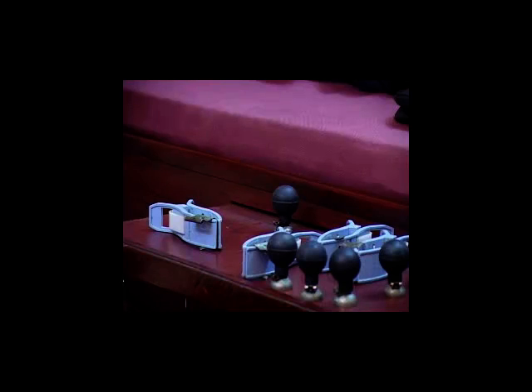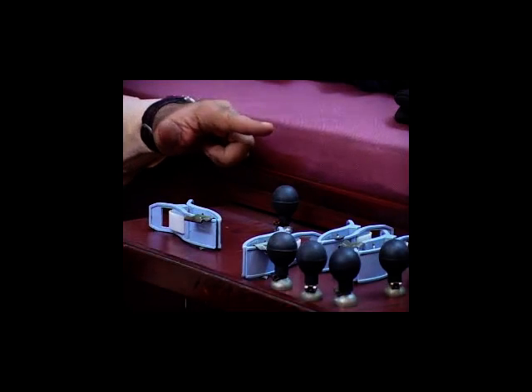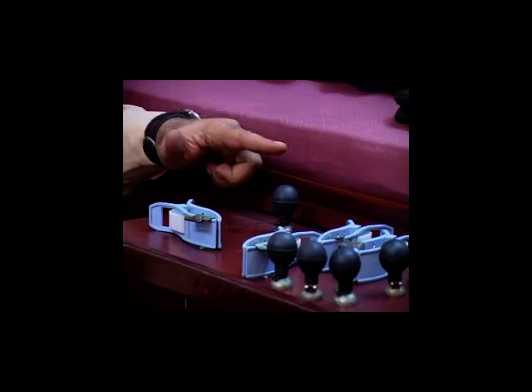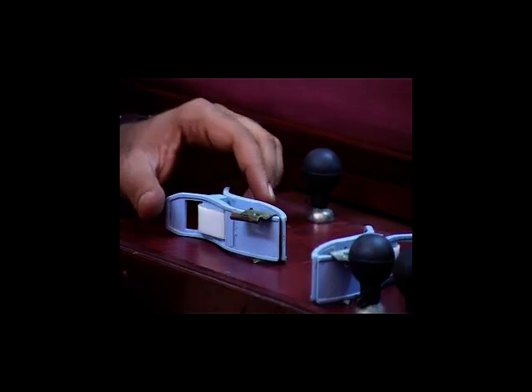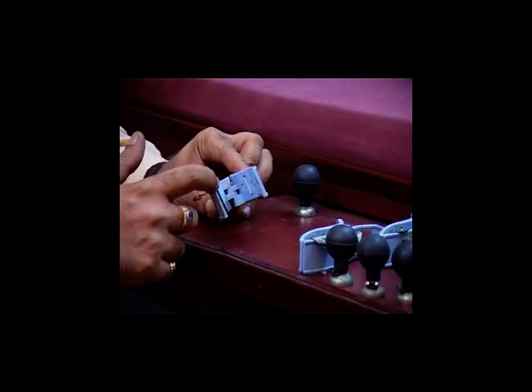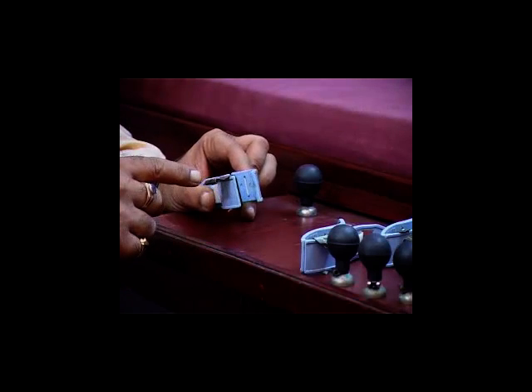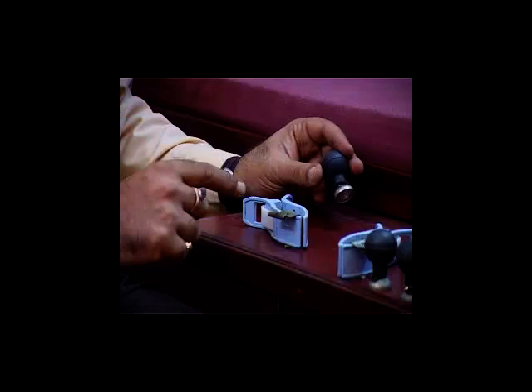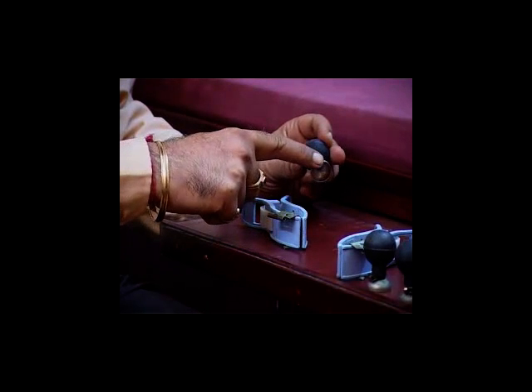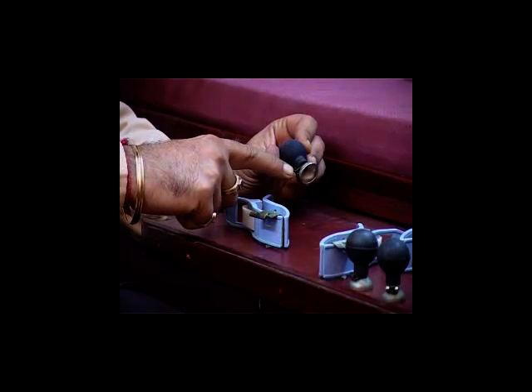The limb electrodes are secured in place by means of clamps, while the chest electrodes are secured in place by means of rubber bulbs. Each clamp has a flat metallic plate which maintains skin contact while the electrode is fixed here. Each rubber bulb is attached to a cup-shaped metallic plate and the electrode is fixed here.